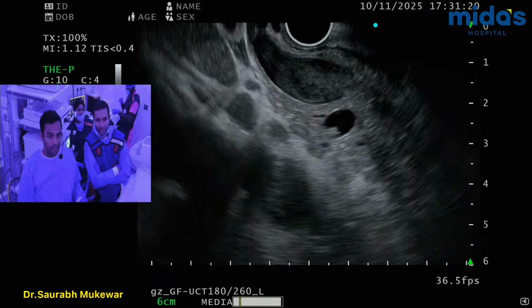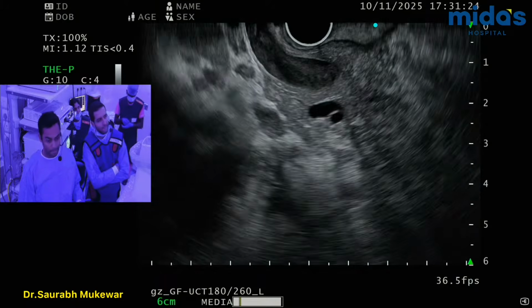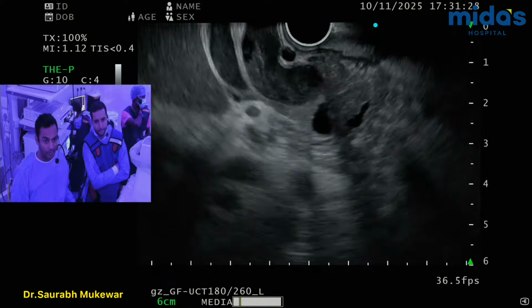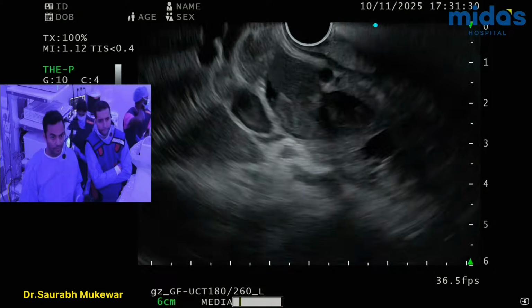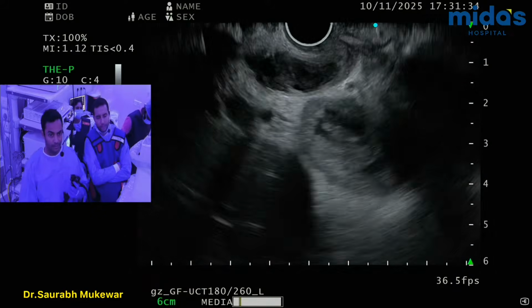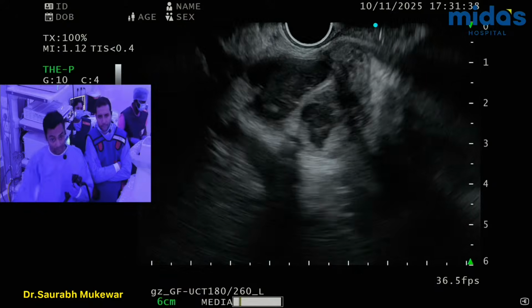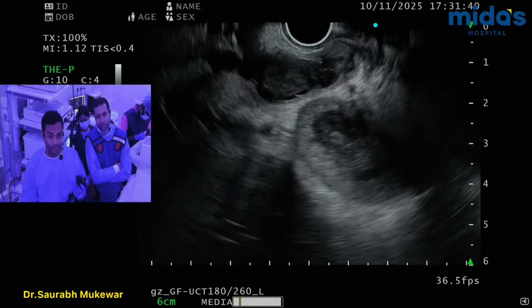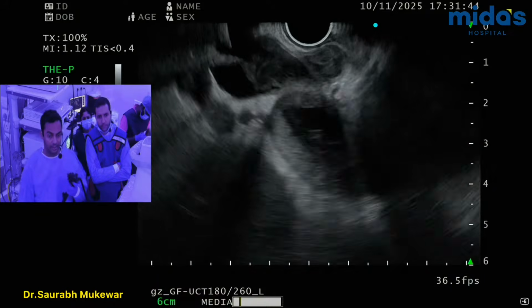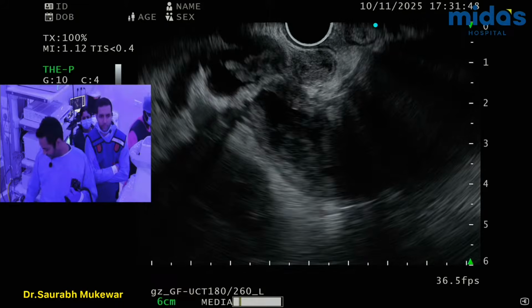Yeah, but position. Now this is a little better for CDS. Let's see. Spot fluoro. Yeah, a little getting more vertical, more heading towards the sort of hilum. And this again, now here we go. So this is the hilum, and this below is the gallbladder, and this is the cystic above, right? Okay. So look at this.